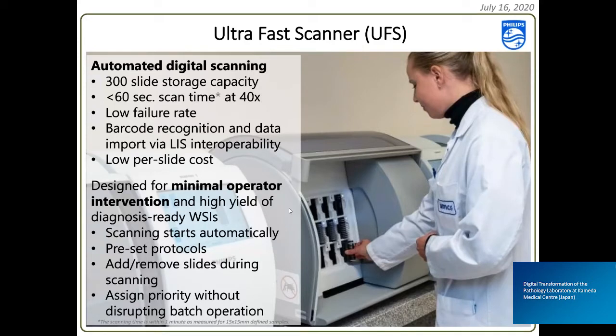To be honest, as medical doctors, we don't deal with this machine on a daily basis, because our technicians manage all the process of loading, barcoding, tagging and troubleshooting. So basically, we just know about these two most important characteristics which I mentioned to you.